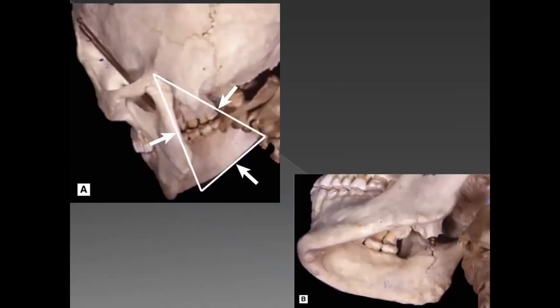So how are these x-rays taken? There is a principle involved in taking these x-rays, and this triangle that you note over here is called a radiographic keyhole. The basic problem in every plain x-ray, before the advent of the OPG and even with the OPG, was that there is superimposition of the other side, which you've noted already in the different pictures that I've shown you.